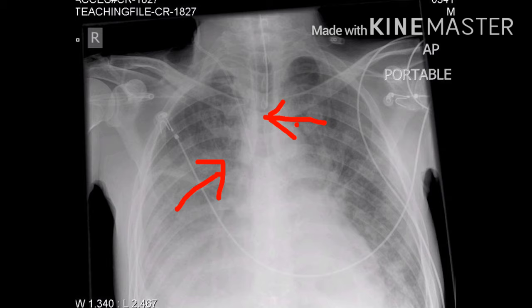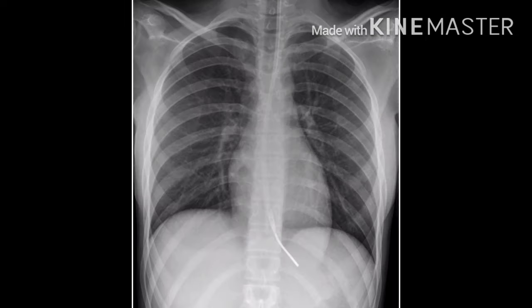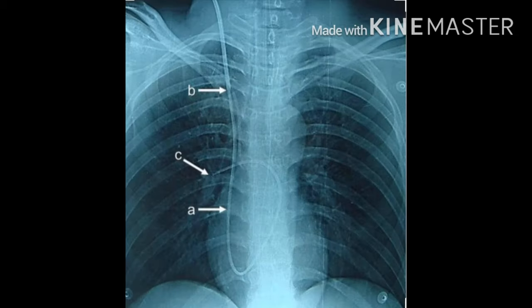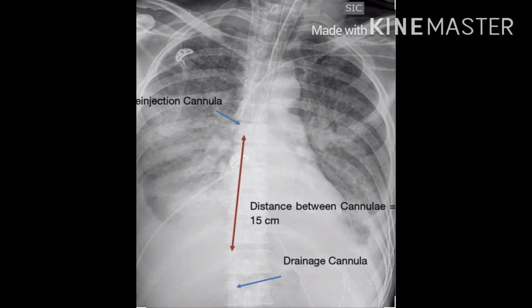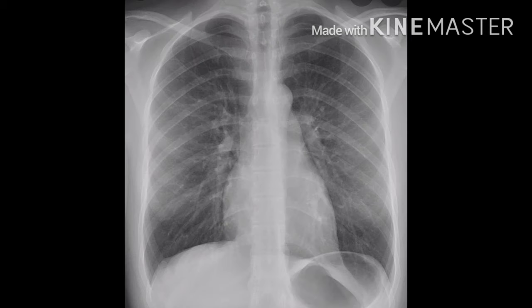E stands for everything else. In this chest x-ray we can see the tip of the endotracheal tube, which should be two centimeters above the carina. We can also see the tip of the central line and ECG leads, the tip of the nasogastric tube, and the tip of the Swan-Ganz catheter located in the right pulmonary artery. In this film we can see two tips of ECMO cannulas — the lower one is the drainage cannula drawing blood out, and the upper one is the return cannula.